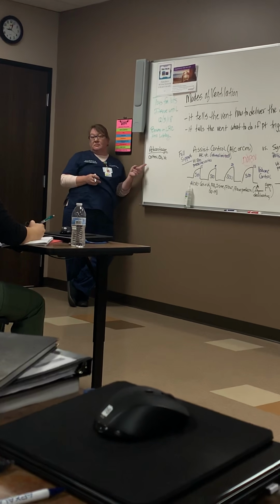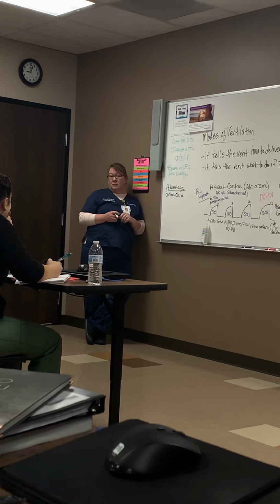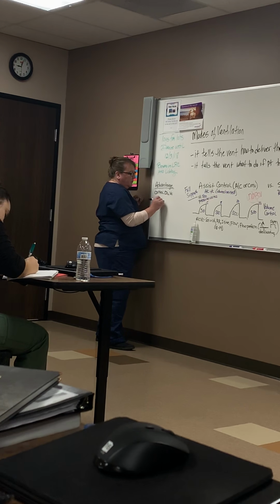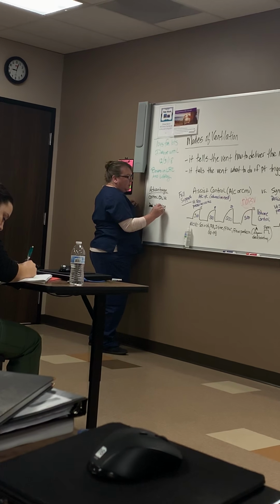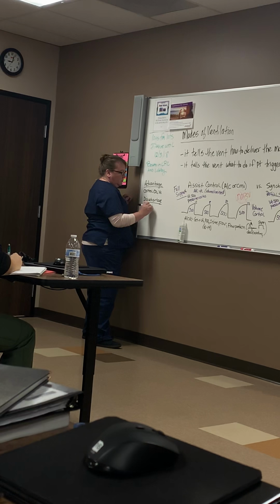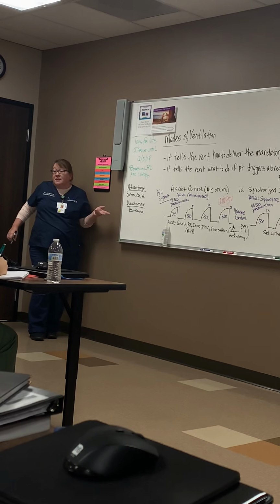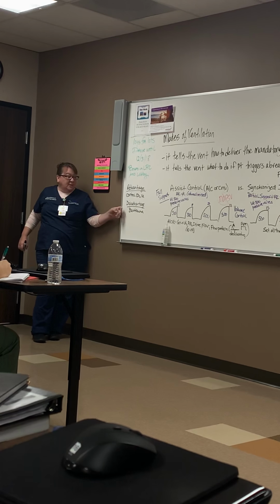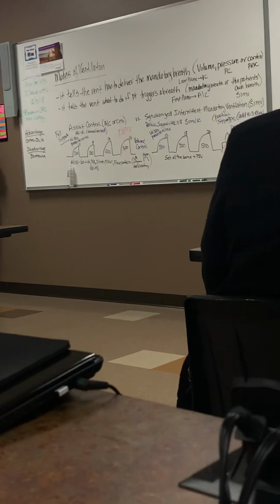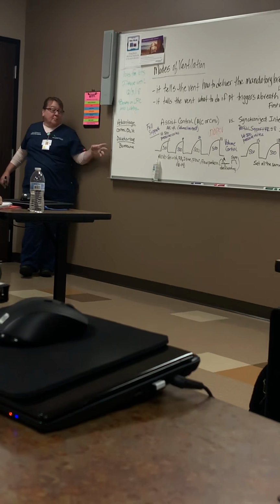Disadvantage? What's a big disadvantage to being in volume control? Barotrauma, yep. Pressure just flies. So you can use AC VC anytime you want, you just have to be aware of this. Be very, very careful. There will be one exception, which we'll talk about, and that's if your plateau gets high.